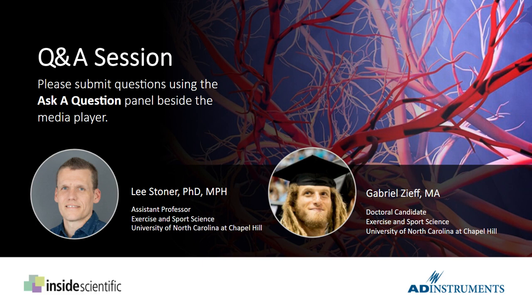Right. And Gabe, we should also point out there that the measurement is different. It's faster with the PPG because we're measuring from ECG, and we're taking the R wave, which is not the start of the ventricular pressure wave.